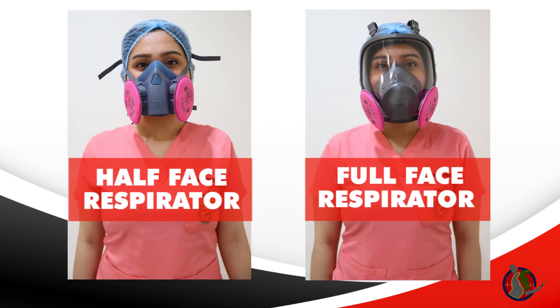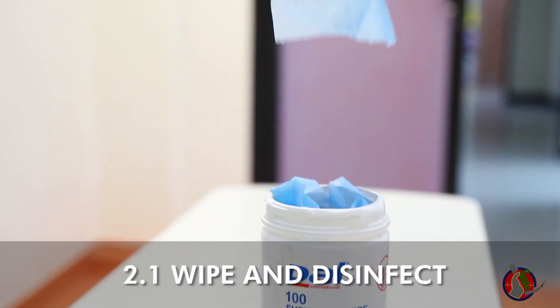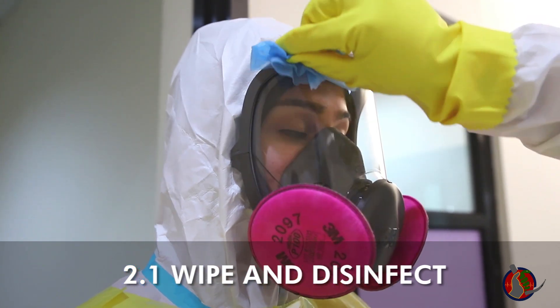Proceed to the next step in enhanced PPE donning. Doffing of respirators is done after removing the hazmat suit and goggles. The buddy wipes the full-face respirator with a disinfectant wipe.